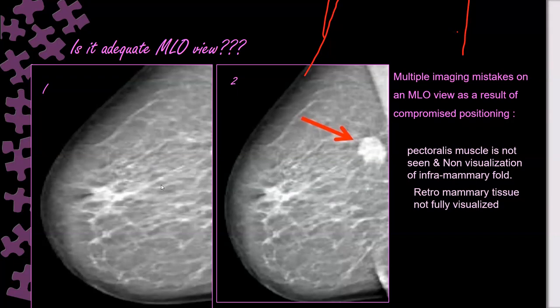We should not accept such things. I have seen similar mammography reported as normal, like this, and the patient having a cancer. She had a clinical problem. She brought to us a mammography report as normal. When we examined her and did ultrasound, we found she had the cancer, and we repeated a proper mammography for her. Do you imagine that? It's a horrible story. While I was working in Soba, she brought me a mammography from another institute. She had a complaint, so I went directly to ultrasound because she already had mammography.